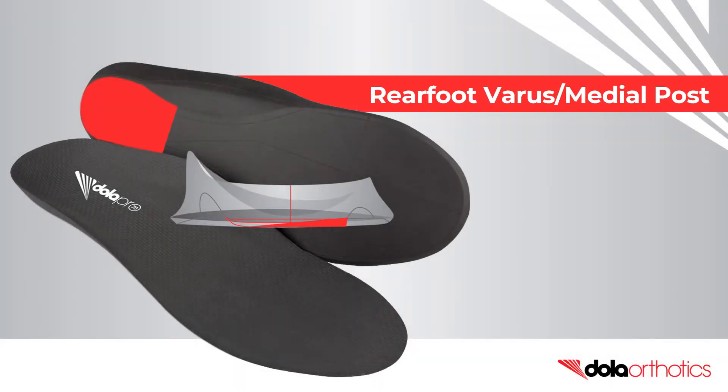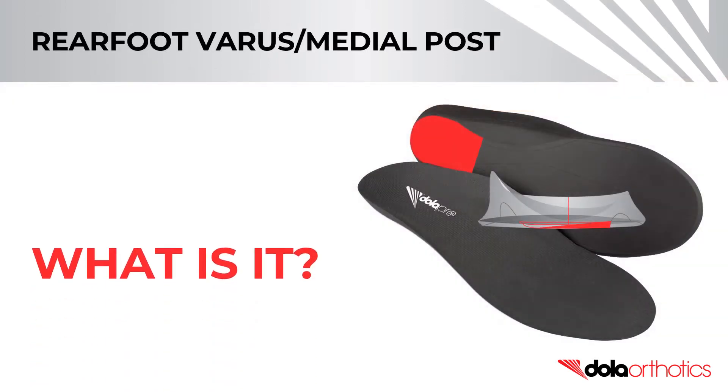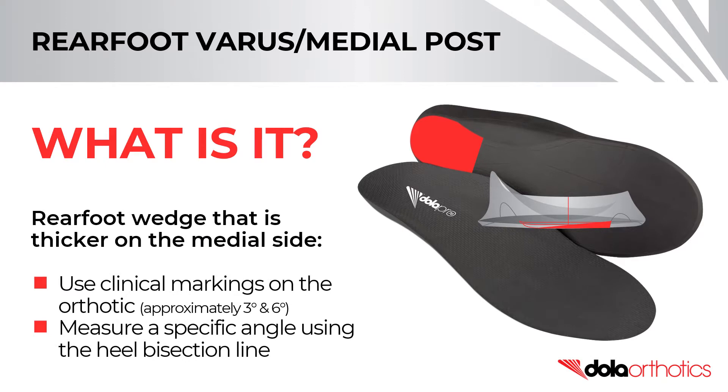How to modify a full-length Dollar Pro orthotic with a rear foot varus or medial post intrinsic grind. A rear foot varus post is a rear foot wedge that is thicker on the medial side.